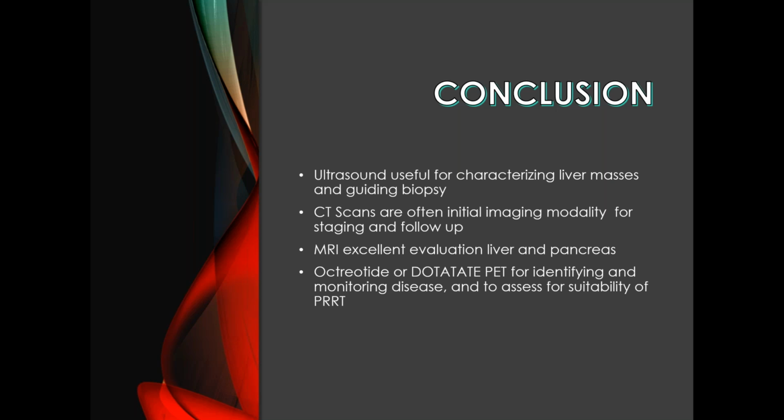And of course, Octreotide and the DOTA-TATE PET are also important and complementary to the radiology imaging, and able to identify disease in some cases better than CT and MRI in certain situations, and good for assessing suitability for therapy. So that's basically my presentation, and I will be happy to answer any questions.